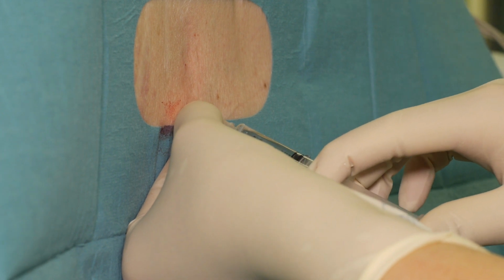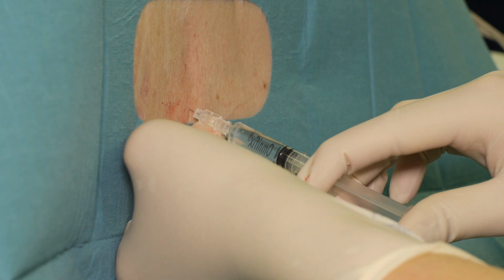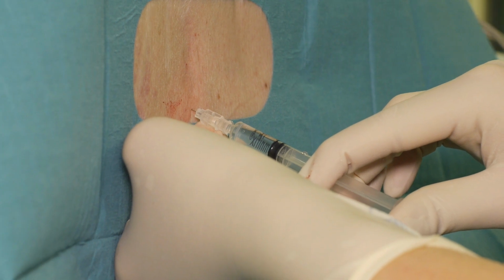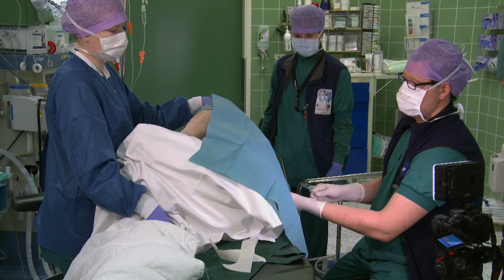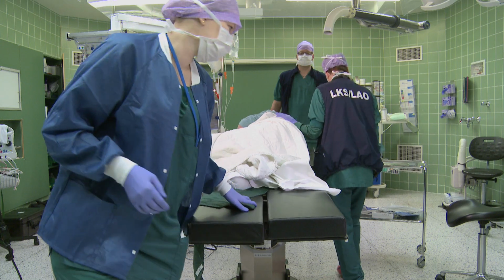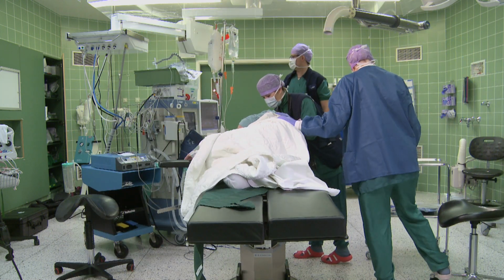The anaesthetic is injected very slowly, avoiding any turbulence. Injecting can cause a warming effect in the legs, and the patient must be informed of this. The doctor will say clearly when he is withdrawing the needle. The patient is positioned so that the anaesthetic will spread only to the pre-planned area.